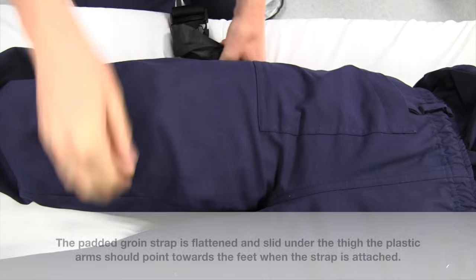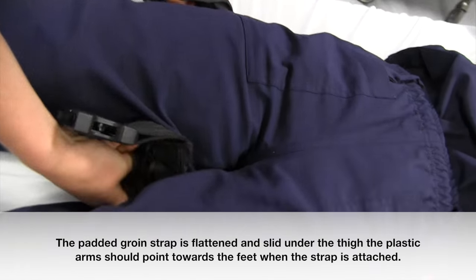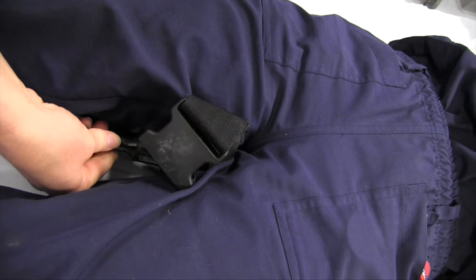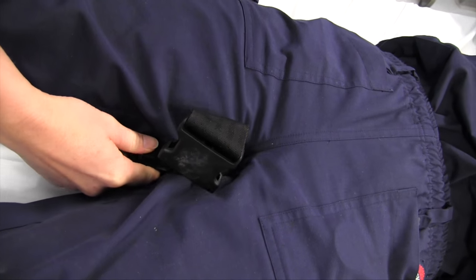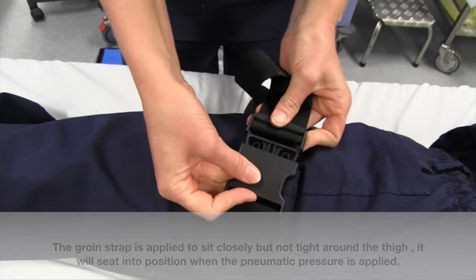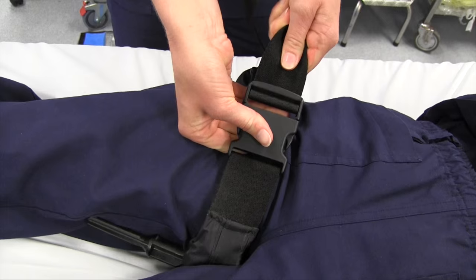The padded groin strap is flattened and slid under the thigh. The plastic arms should point towards the feet when the strap is attached. The groin strap is applied to sit closely, but not tightly around the thigh. It will seat into position when pneumatic pressure is applied.